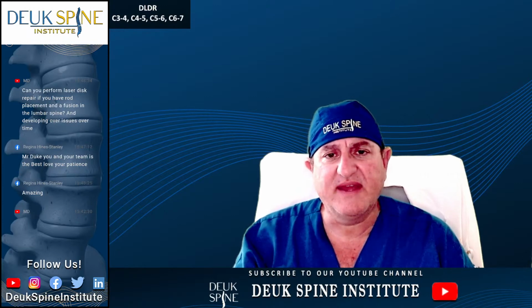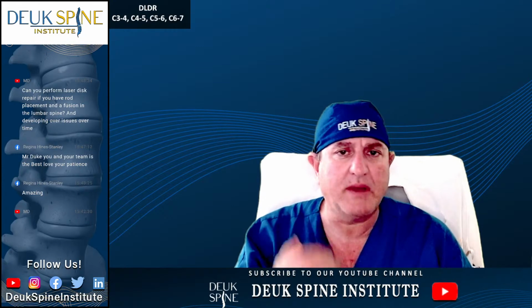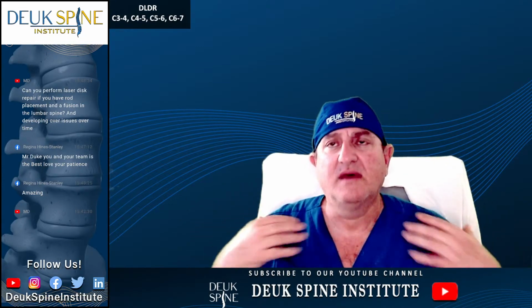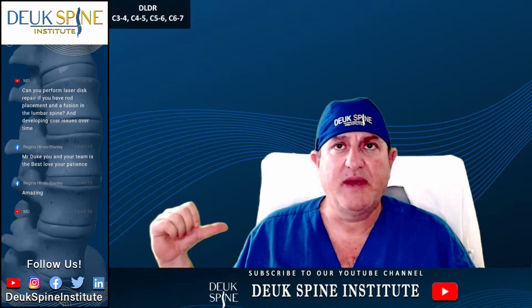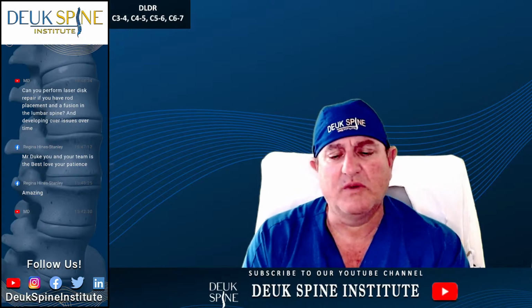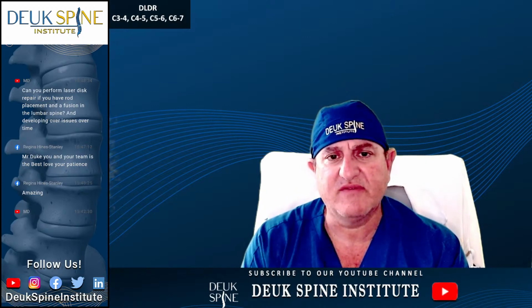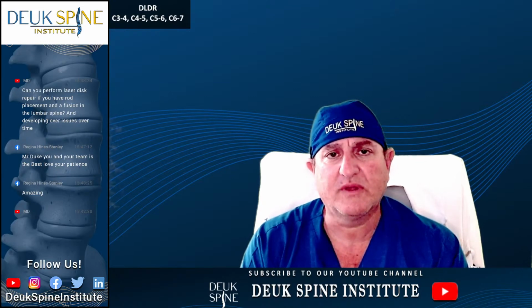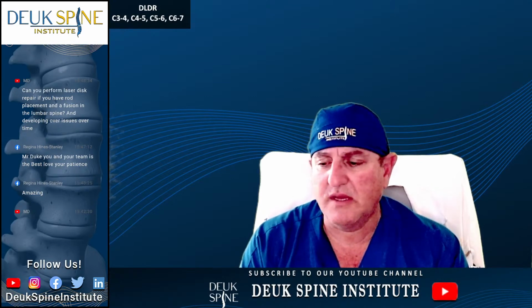And I'll tell you, if I didn't have this machine here this week, I would not have been able to see that bottom disc, because this patient's shoulders are so broad and wide, and the neck is short, that the penetration through the shoulders and through the C6-7 disc would be impossible on any other unit I've ever used. So we're lucky. We had the one fluoroscope in the world that will allow us to do the surgery today, and it worked out great.